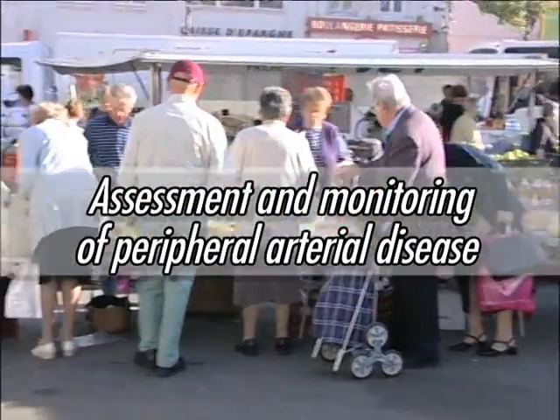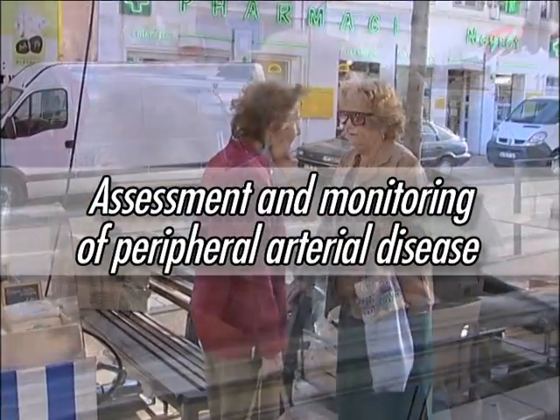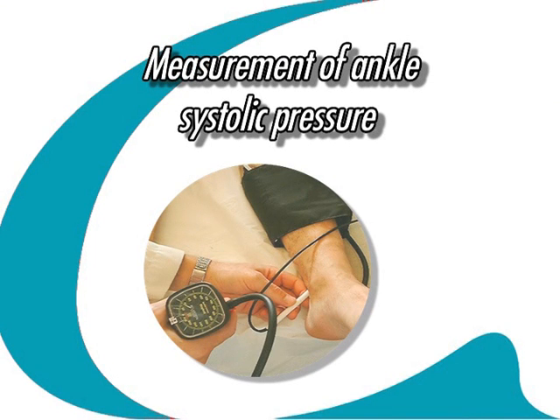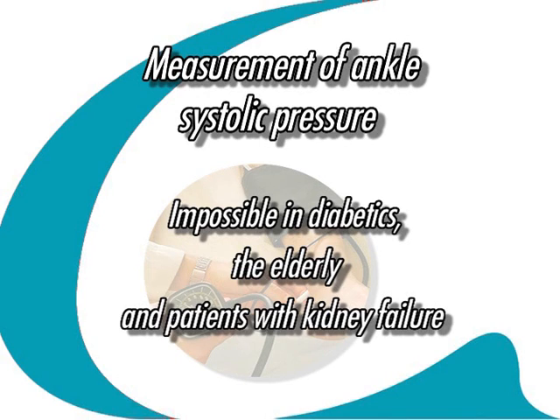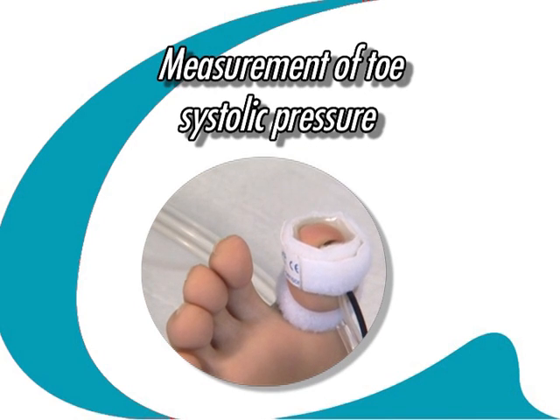With the aging of the global population comes an increased incidence of vascular disease. The measurement of ankle systolic blood pressure is an essential element in the assessment and monitoring of peripheral arterial disease. However, in some groups of patients, notably diabetics, the elderly and those with kidney failure, medial arterial calcification makes the wall of the lower limb arteries incompressible and this measurement is impossible. In this case, systolic blood pressure can be measured in the toe where there is usually less calcification.